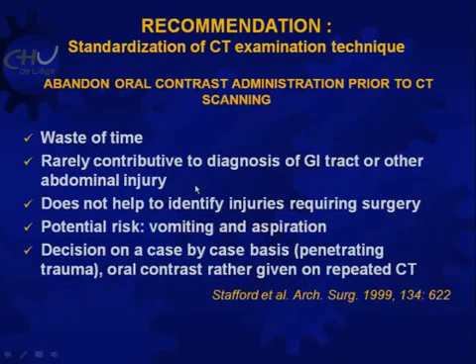Should we give oral contrast, yes or no? Of course, the answer is no. There's no time in a severe polytrauma patient, in a shock patient, to give oral contrast. It's a waste of time. It rarely contributes to the diagnosis of a GI tract injury, which was the reason the oral contrast medium was given, or other abdominal injury.